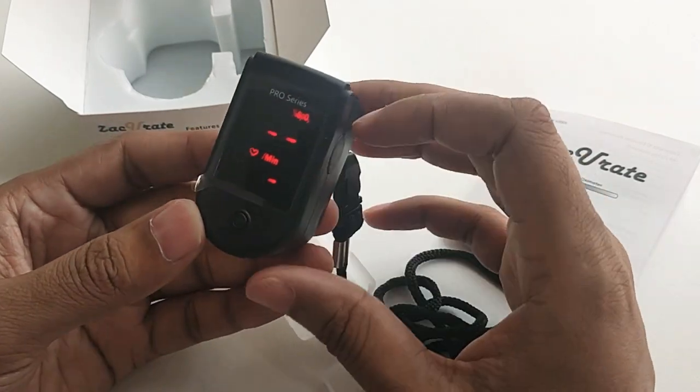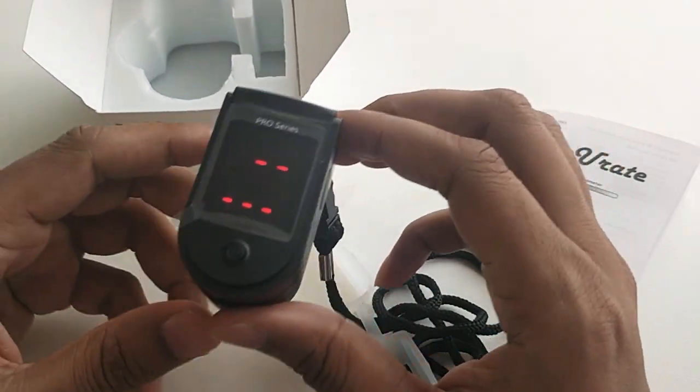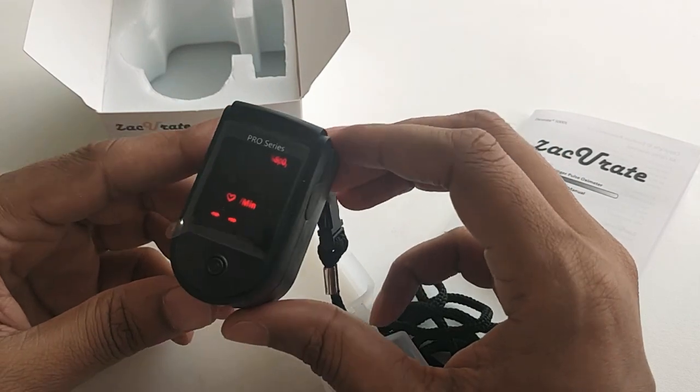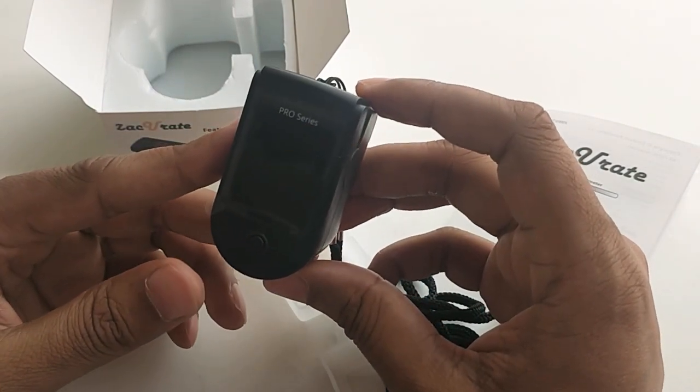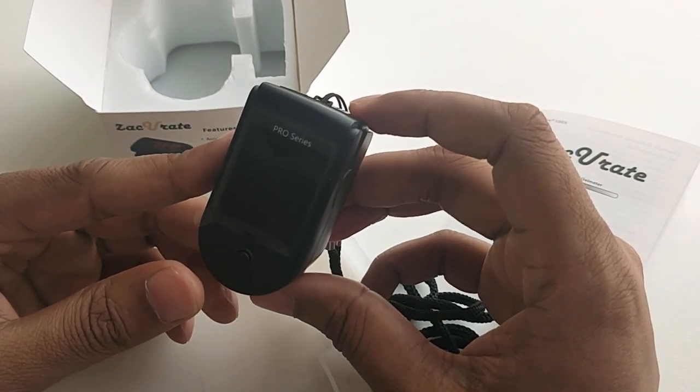This is the pro series of Z-Decorate — I bought it and it cost me around 39 pounds. On this display you will find two parts: one is your oxygen level and the other is your pulse rate.